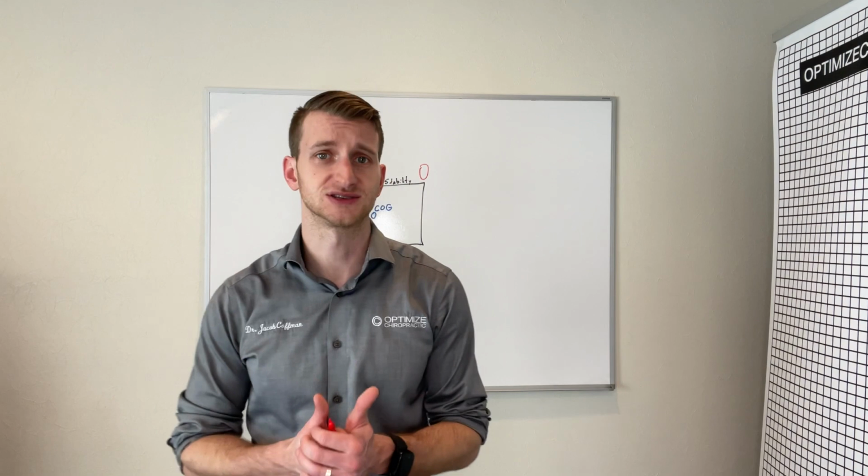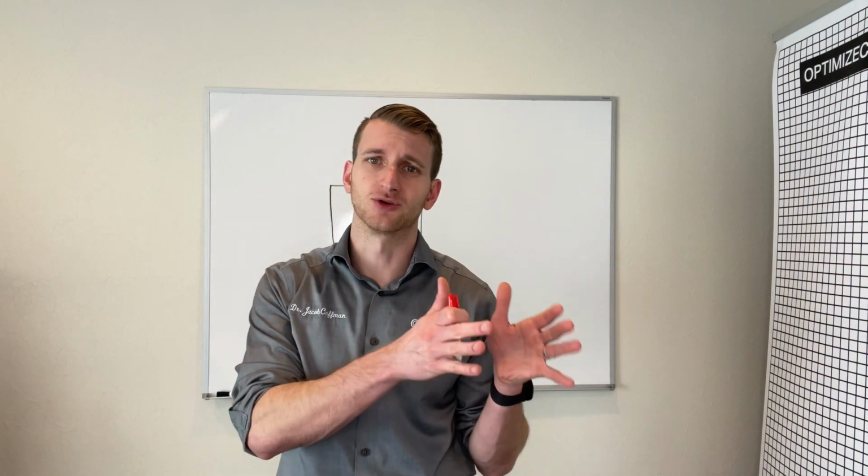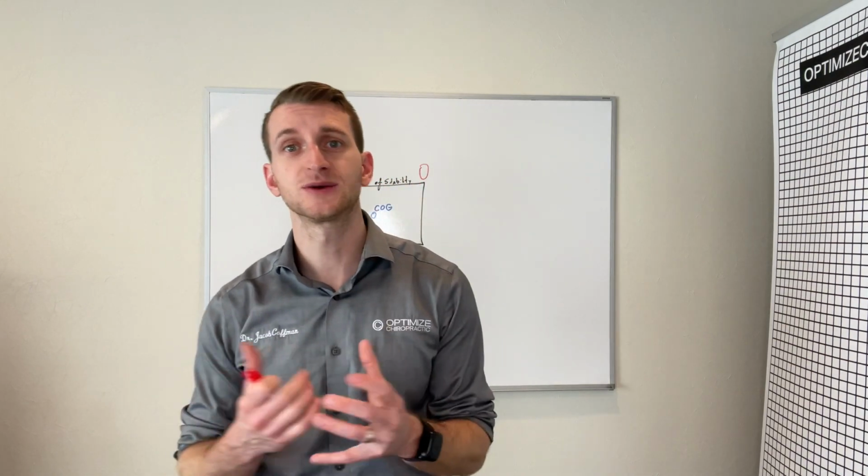If someone is coming to see us here at Optimize Chiropractic, we use the limits of stability as a way to measure a baseline level of movement. We look at a lot more than just limits of stability, but the limits of stability gives us a baseline of how well the individual is able to move at the beginning of their care, and also lets us know if there is an asymmetric or uneven pattern with their movement. During this process, we are also able to watch how they coordinate their movement and how body aware they are. Two things that will affect the individual's specific treatment plan.